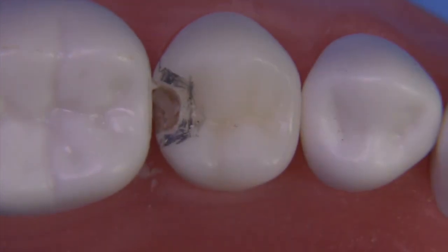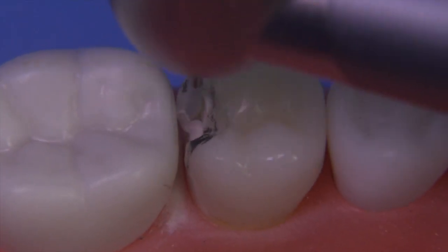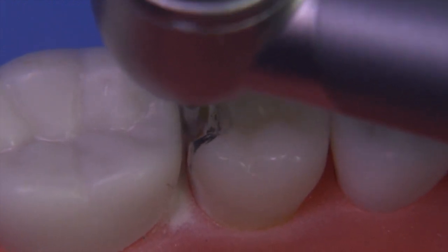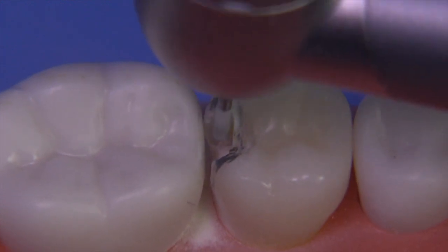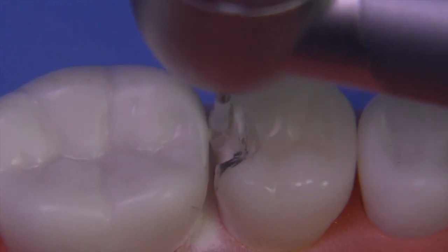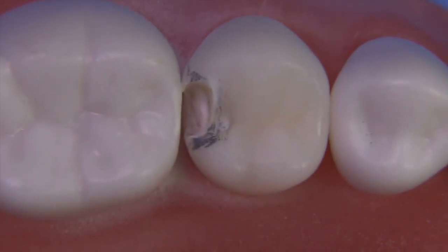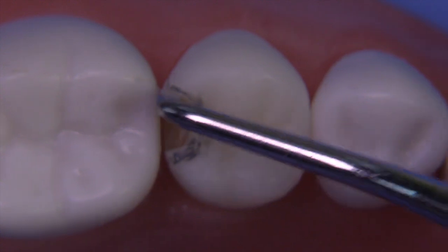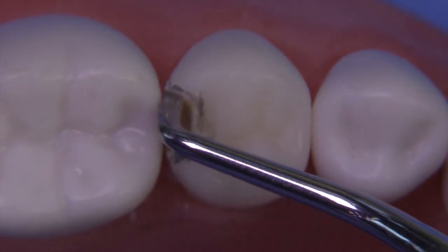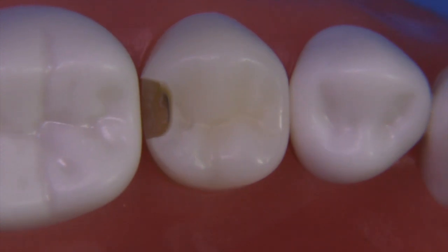You can see that basically we're getting close to something that looks like a Class III preparation. Look at the caries there on the axial wall. We're going to continue a little bit further with the 245 — undermining and chipping like we've done in other videos. The preparation is nearing completion for a composite. Using our enamel hatchet to remove any loose enamel, and when we look from the distal view you can see the caries so beautifully present there on the axial wall.